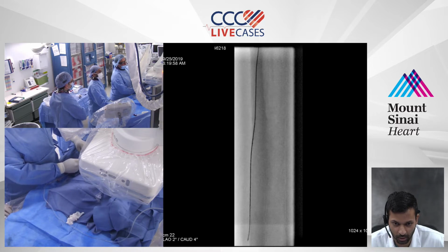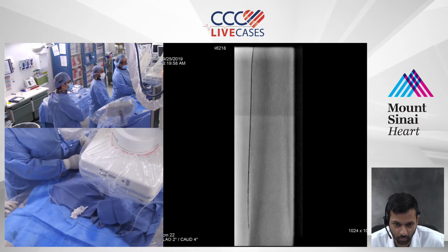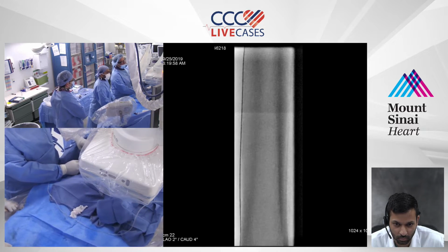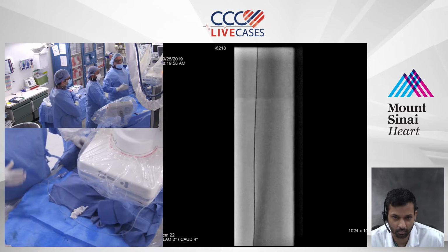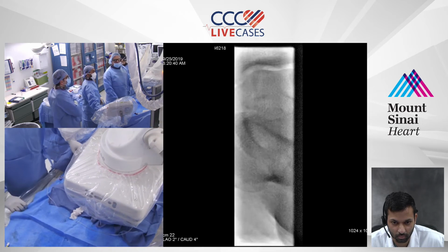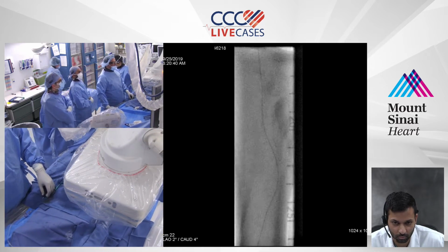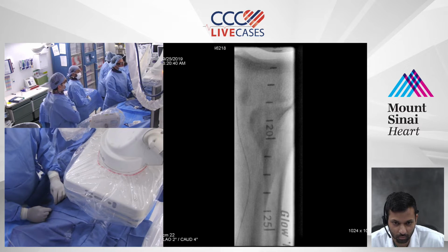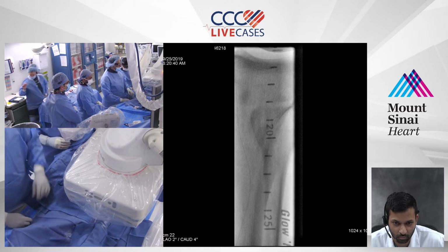So depending on how easy it is to access is another consideration. Out of the two, which is more easy to access, which is the area you access, and then go with that? Tell me, if you had the choice of a PT or an AT, and say they were both reasonably robust vessels you could get with ultrasound, is your logic of getting the PT because it's more superficial? Is it better to go with an AT?